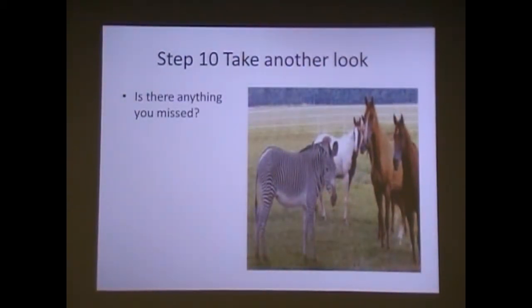Is there anything you missed? Just take one more look. We all focus in and we're like, oh, I've got this. This is an inferior, this is that. But look at the whole picture one more time, slow down for a second and go, oh, you found something else, and it changes your whole clinical picture.